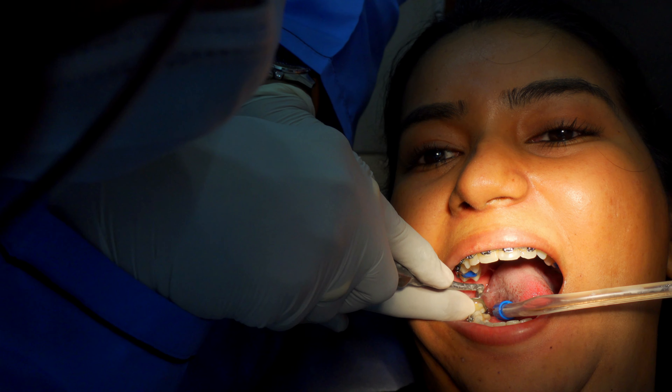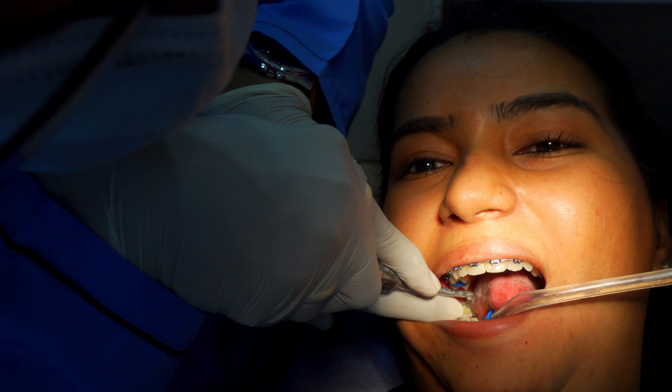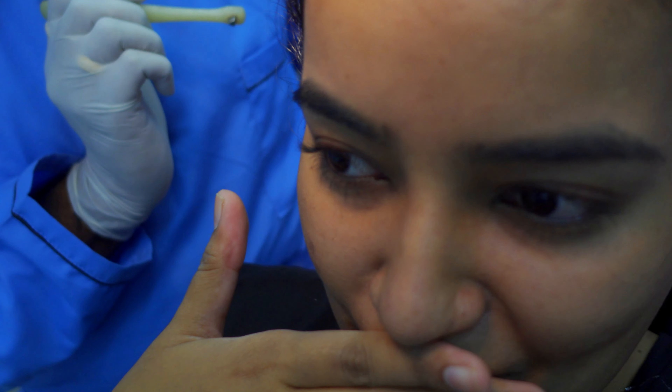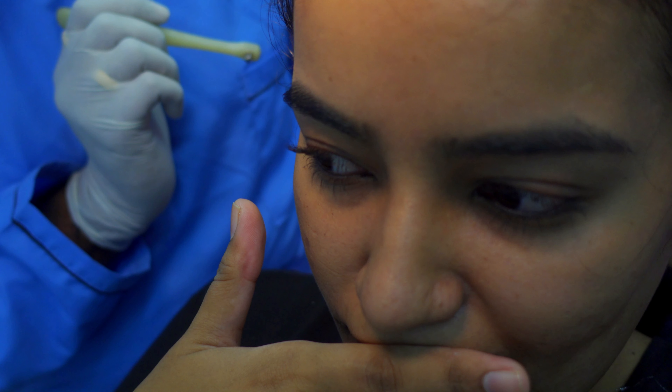You can see in this footage that I didn't want to do it, and I told him that. That's when he decided to put some anesthetic spray so I could get a little relief. This was so hurtful — God bless the person who invented anesthesia — because when he put on the spray, I got a little relief.